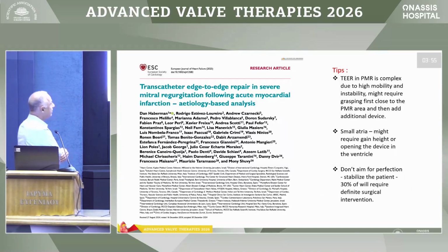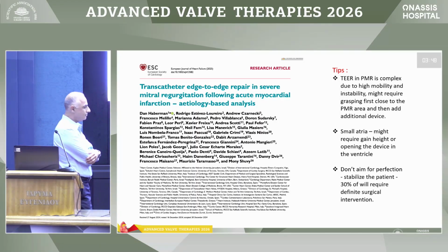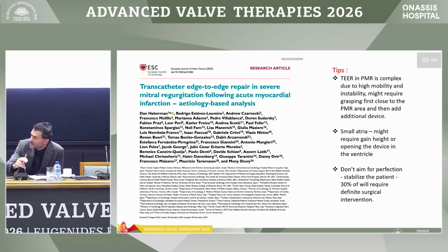Yes. This is fantastic that you're showing that, because I think these pre-cardiogenic shock patients with STEMI and this constellation, even with ECMO and unstable, they really benefit from that.